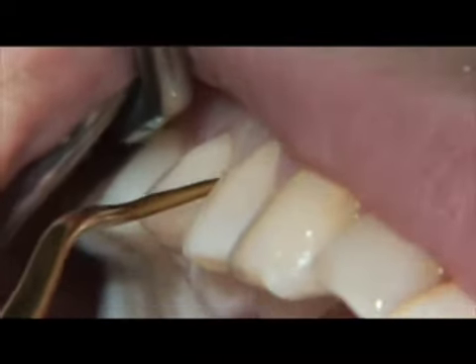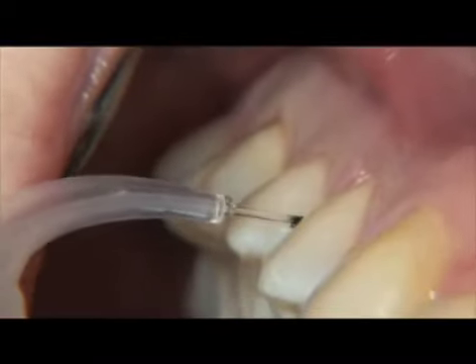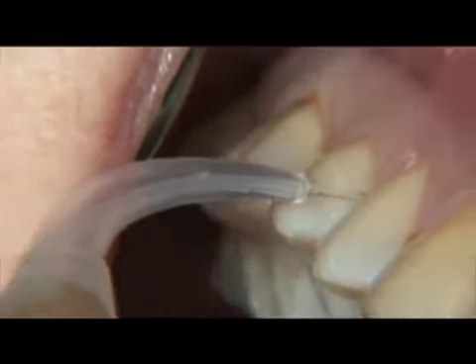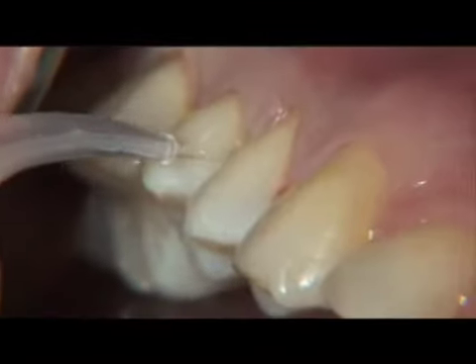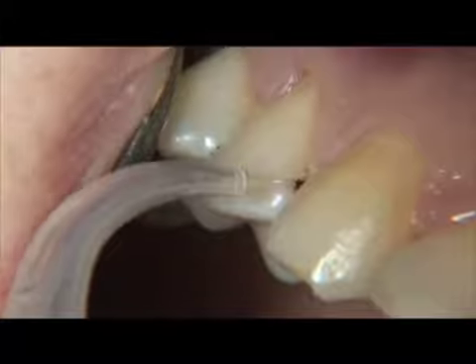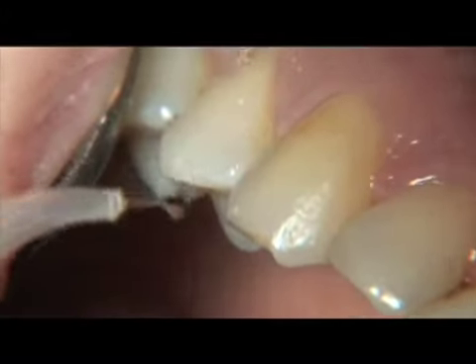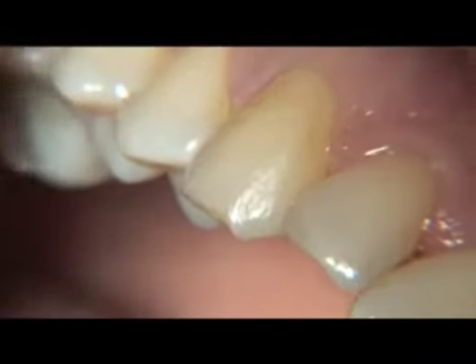Hand instruments are now employed to refine the subgingival surfaces of the tooth. The next step that we will demonstrate in laser periodontal therapy is laser curettage. The chief advantage of laser curettage is that it allows for a non-surgical approach, gaining easier access to deeper calculus deposits following ablation of diseased epithelium and hemorrhage control.